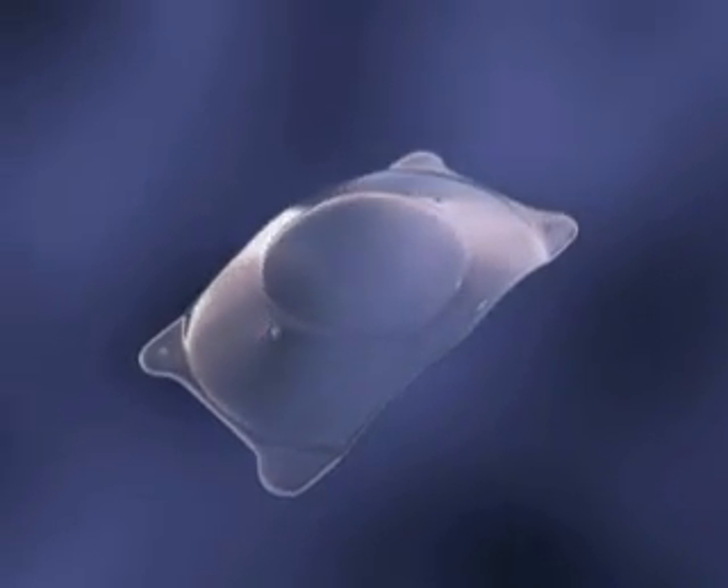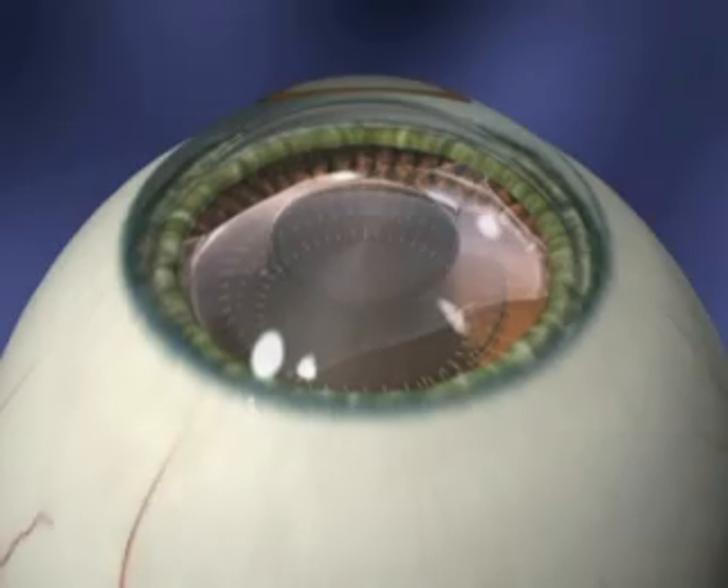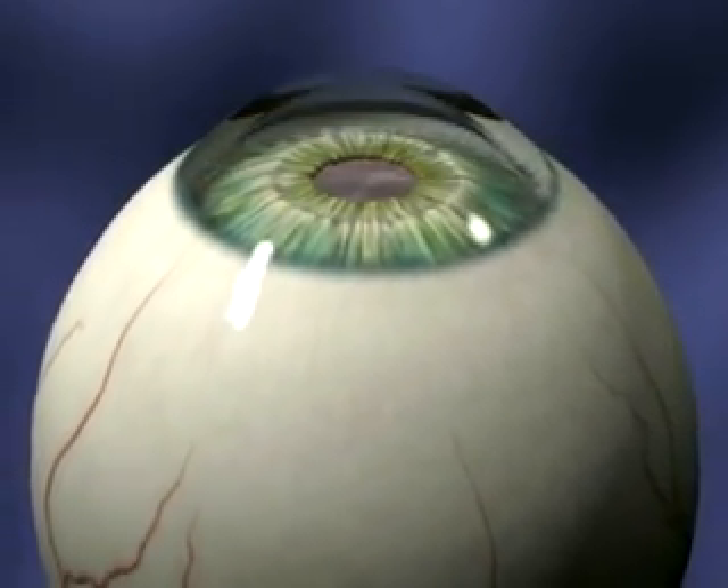This chapter will provide an animated guide to implanting the STAR-VISION Surgical Implantable Contact Lens, or ICL. Remember, in cataract surgery, the crystalline lens is removed. In ICL surgery, the crystalline lens is preserved.